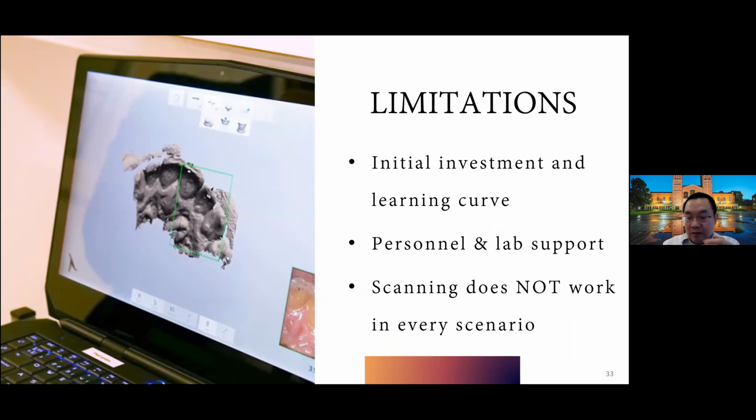Okay, so I'm sure at this point you're already thinking, let's go digital, let's go digital. Are there any caveats? Yes, there are limitations, right? There is always the initial investment and learning curve. When we're talking about a $100,000 purchase, that's a big purchase. You have to think about that twice, especially if you're setting up a new practice. It's difficult in the first couple of years to commit to that, especially after buying a new practice and balancing your books, and then maybe thinking about getting implants and expanding your scope, and then maybe thinking about digital.